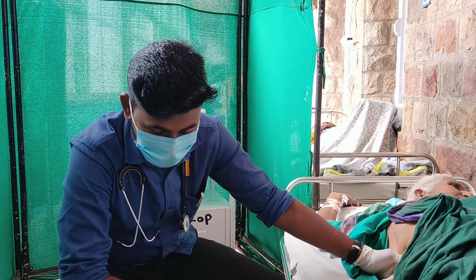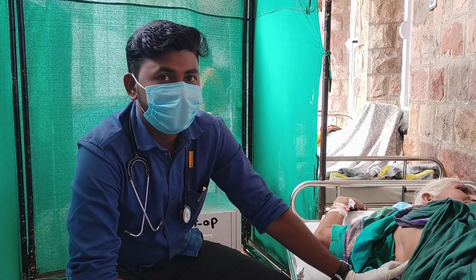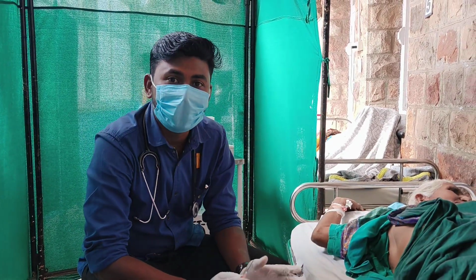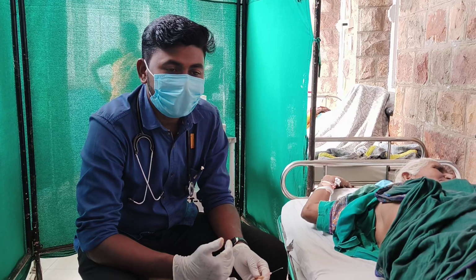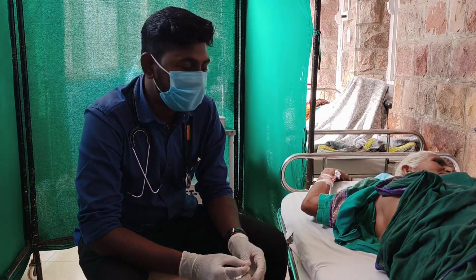So guys, this is one important procedure called needle aspiration. It is very helpful in a patient with tension pneumothorax. When the patient has tension pneumothorax, the only thing the patient will present with is severe breathlessness. In this condition, the only thing to be done is needle aspiration.